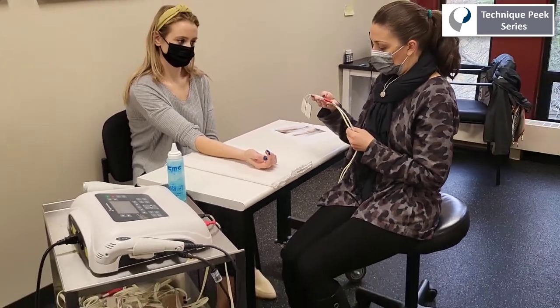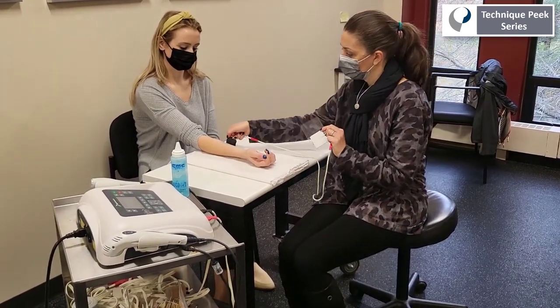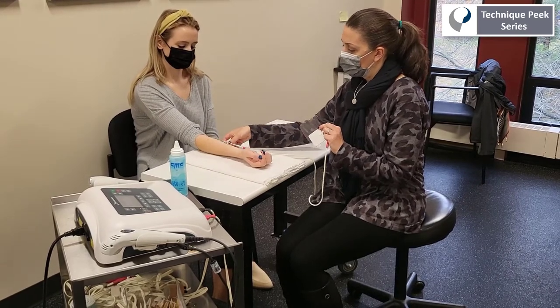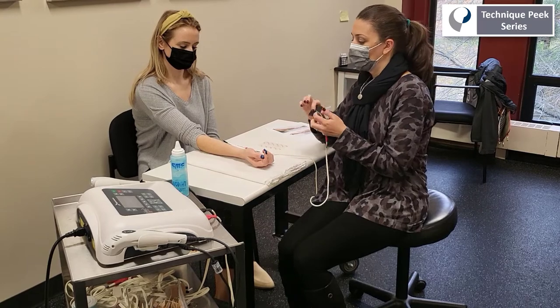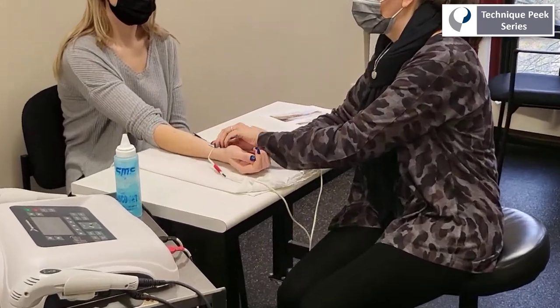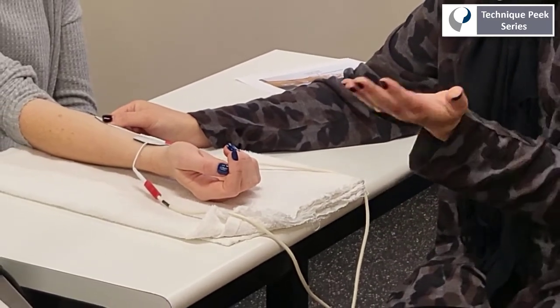We could use palpation with attempted finger flexion to locate that muscle belly, and once we've located it, we can place our proximal electrode — our active electrode — over that muscle belly, and then place one distally, at least one pad width away from that proximal pad, over the tendons to create a circuit.